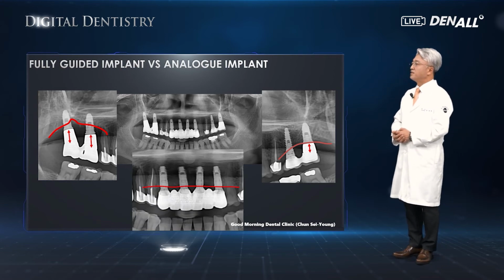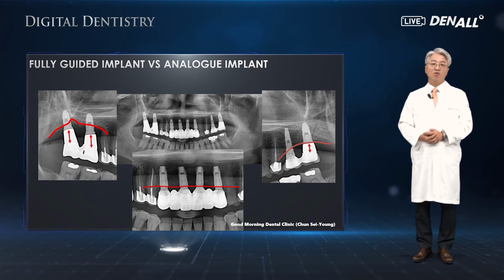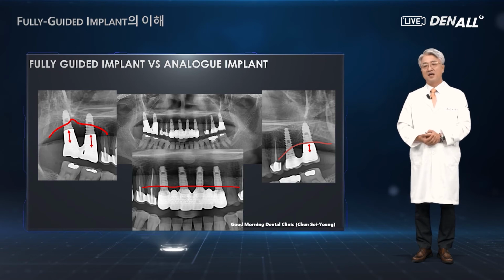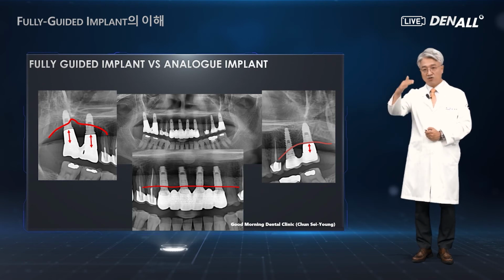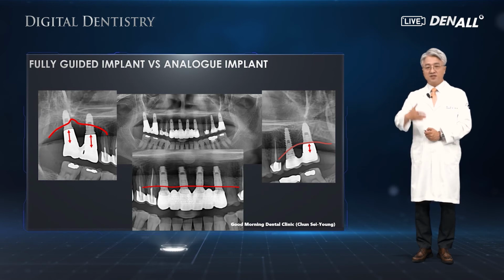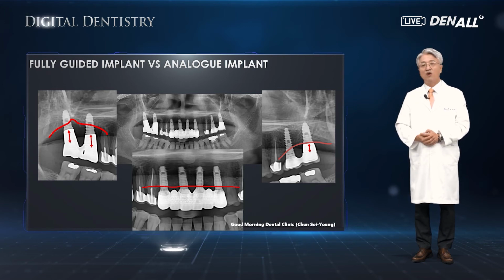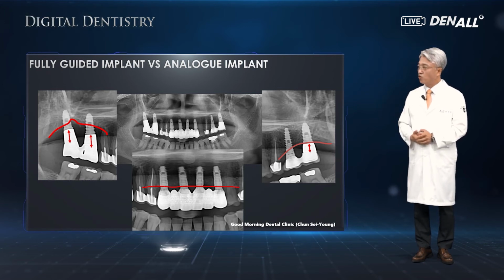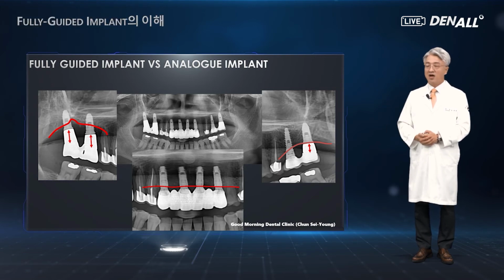So, for the anterior region implants, I try to make the bone level as much in line with the adjacent teeth with the bone grafting. In the alignment, if I try to align them just manually, I don't believe the bone level that I desired could have been achieved. So with the guided surgery, the angles and positions of implants were made as planned. As a result, a prosthesis like this was achieved.